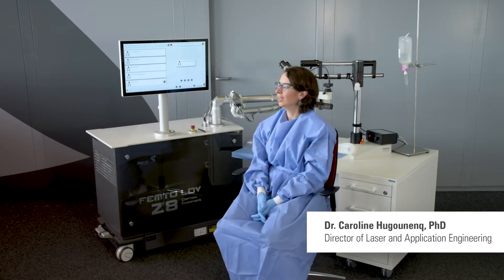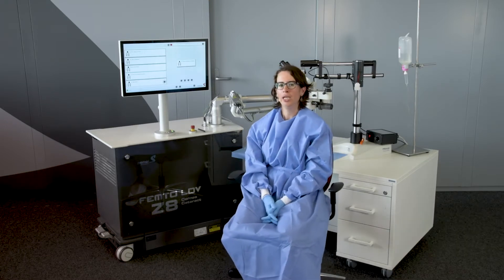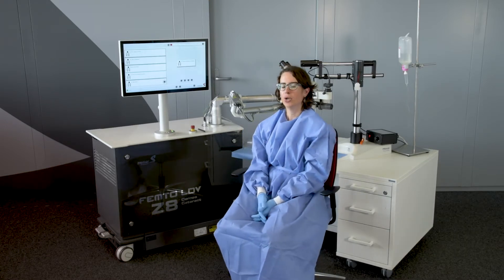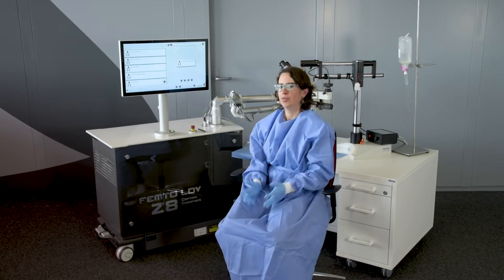Hello everybody, I'm Caroline. I will now do a CLEAR vet lab with the Femto LDVZ8. It's a brand new application that we have on our system. Just enjoy the vet lab.